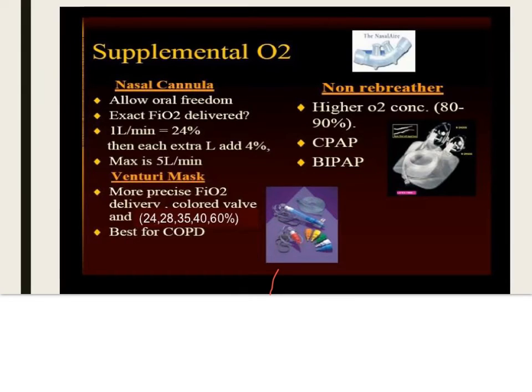We're going to talk about nasal cannula. Remember, it's low flow. Advantages is that it allows movement. It allows the patient to be more mobile. It doesn't interfere with speaking, doesn't make their voice sound muffled. So this is the nasal cannula.